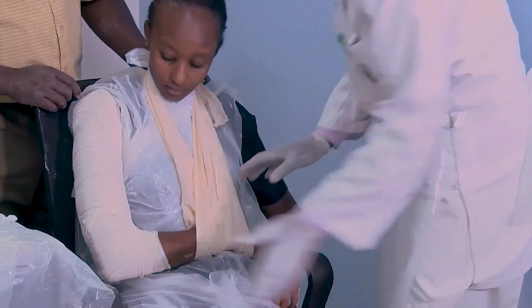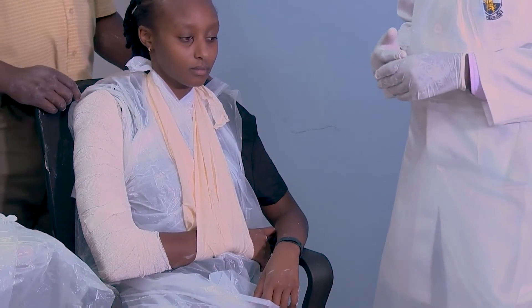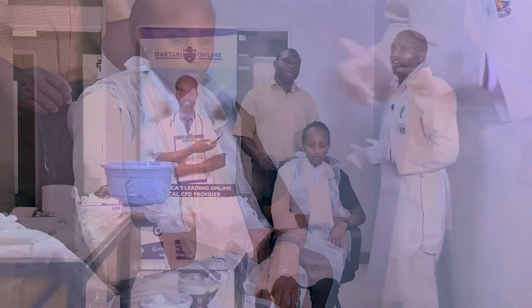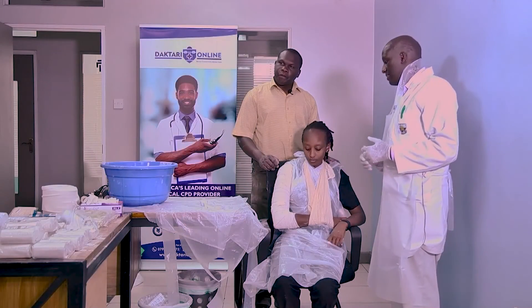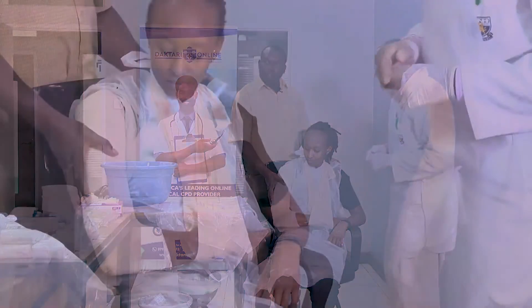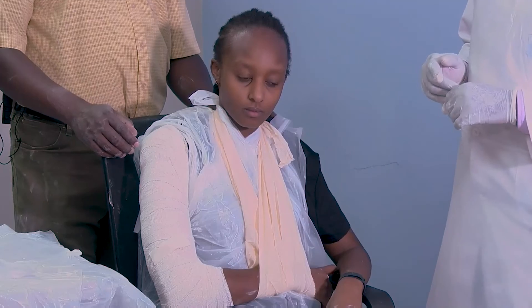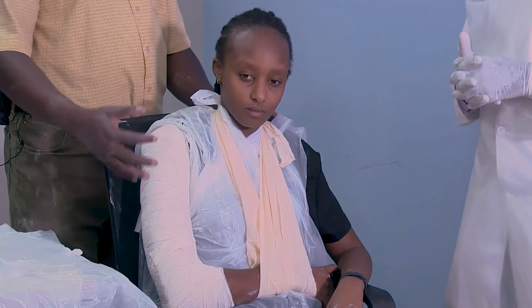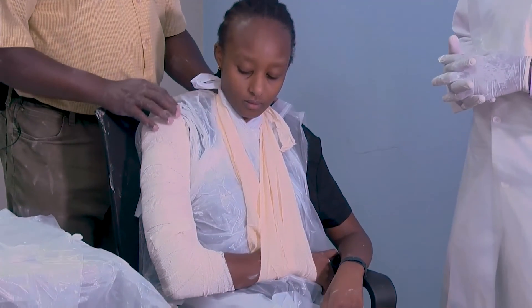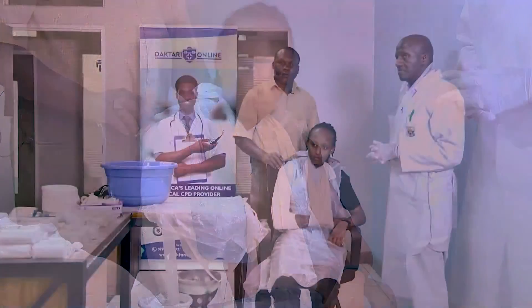Give instructions to the patient on how to take care of the U-slab, do a check X-ray, and follow up the patient until the bone is confirmed to be in position. Sometimes this initial slab may lead to a further humeral operation. It may look daunting to put on, but with practice one should be able to do that. Thank you.